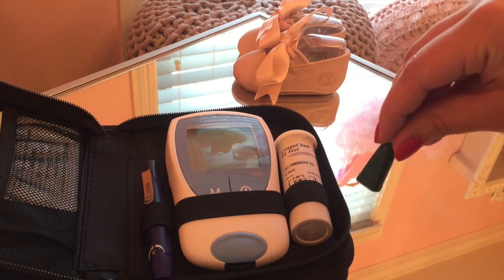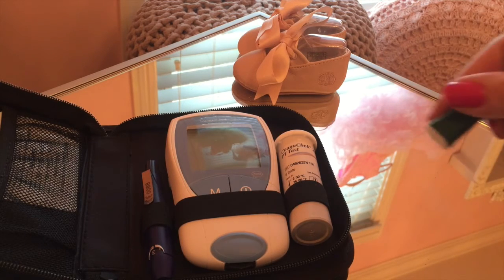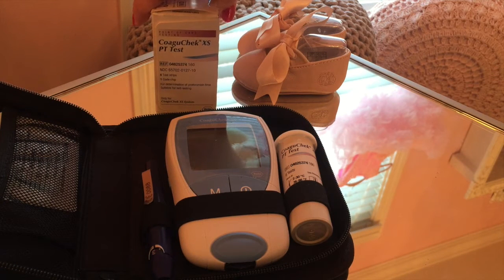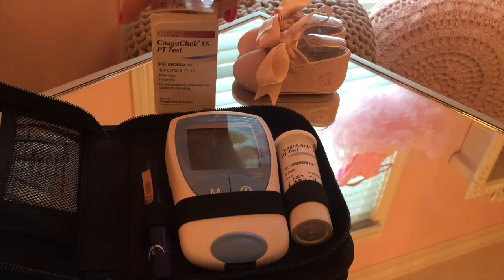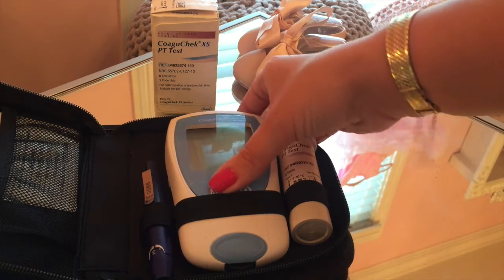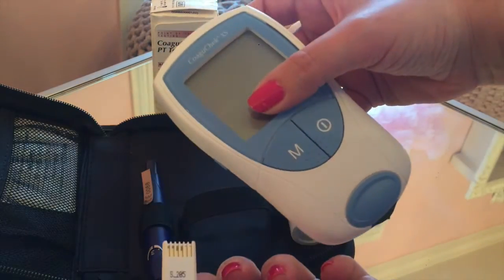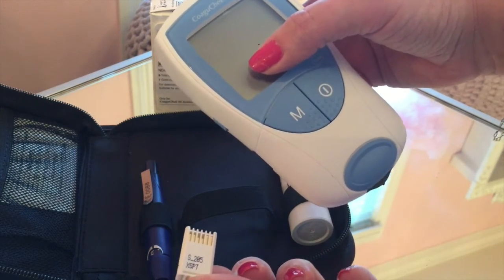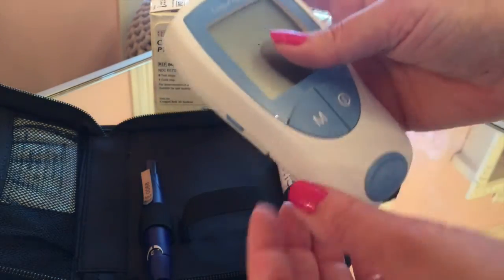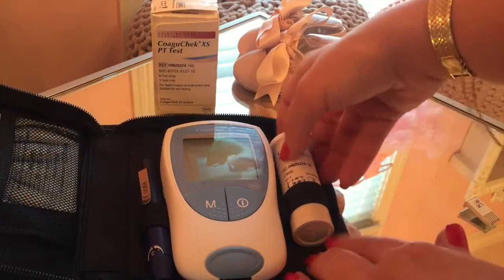I prefer the disposable prickers just because there's no open needle. I have children — if I forgot to throw it away, it's no danger. I know that's silly, but I'm just trying to be cautious. You will also have a box, and this is the test strips. Inside you'll find a capsule with the test strips and also a chip that you insert into your machine. That's probably the hardest thing, and it's not hard at all — just remembering to swap out the chip every time you get a new box.